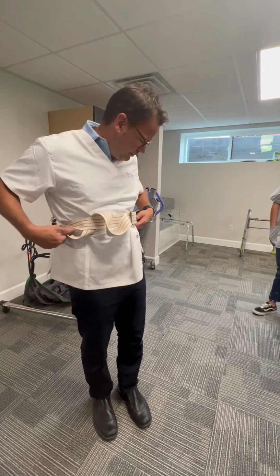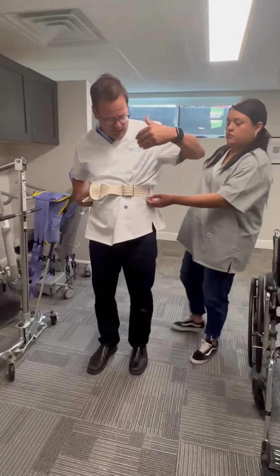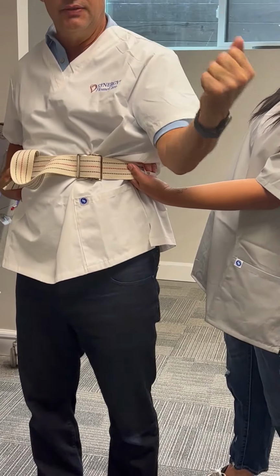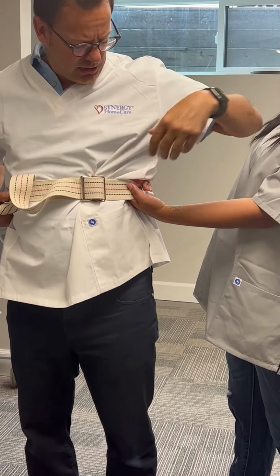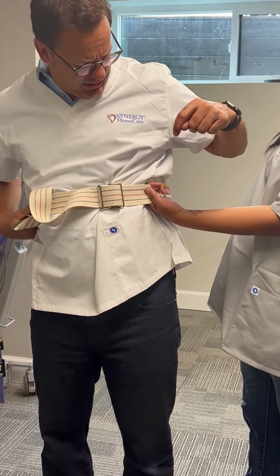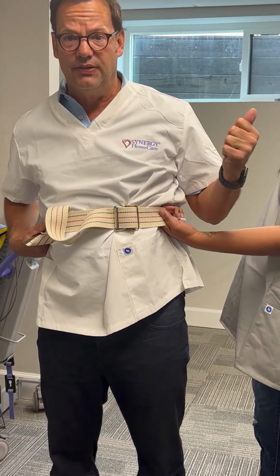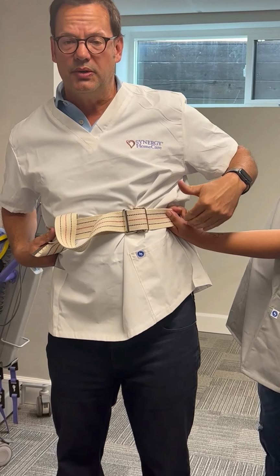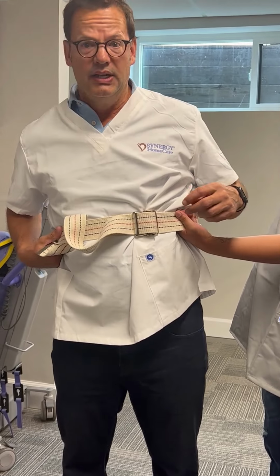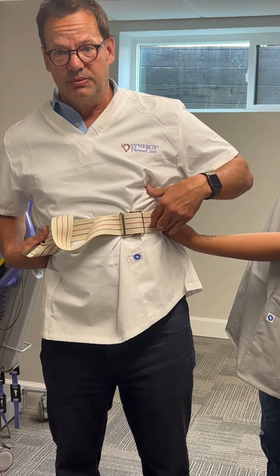The other thing that's very important when we use a gait belt, and I'll have Giselle demonstrate, is our hand is always faced up. For us to have a firm grip, we always want our hand positioned as you see it with Giselle here. You'll see she has a strong hold. The belt is in her hand, not in her fingers. That is a very important position so that we have a safe hold. If they were to fall, we would be able to support them to the floor.